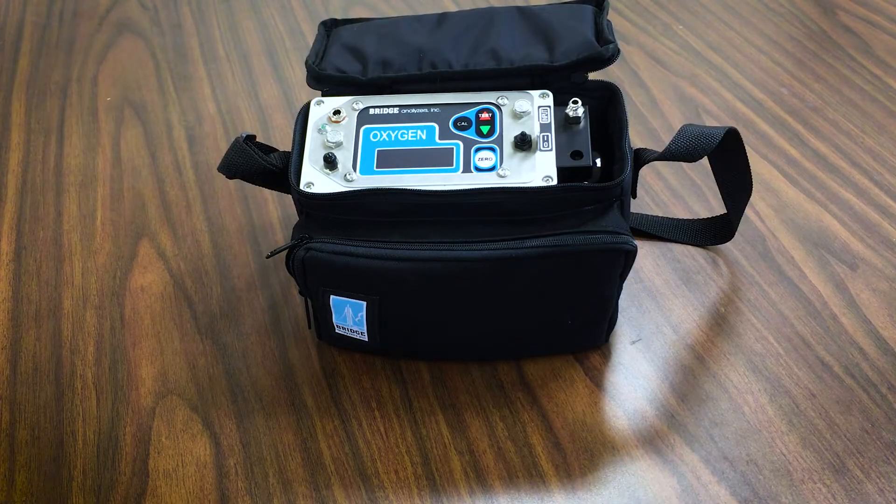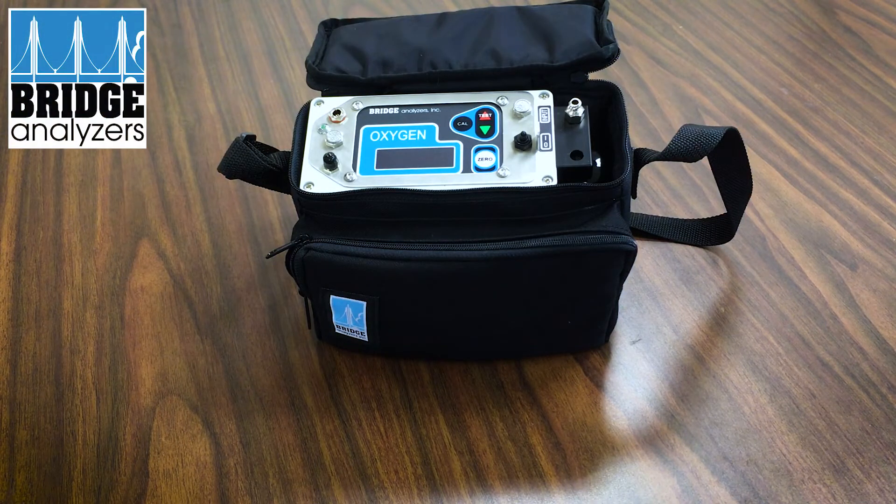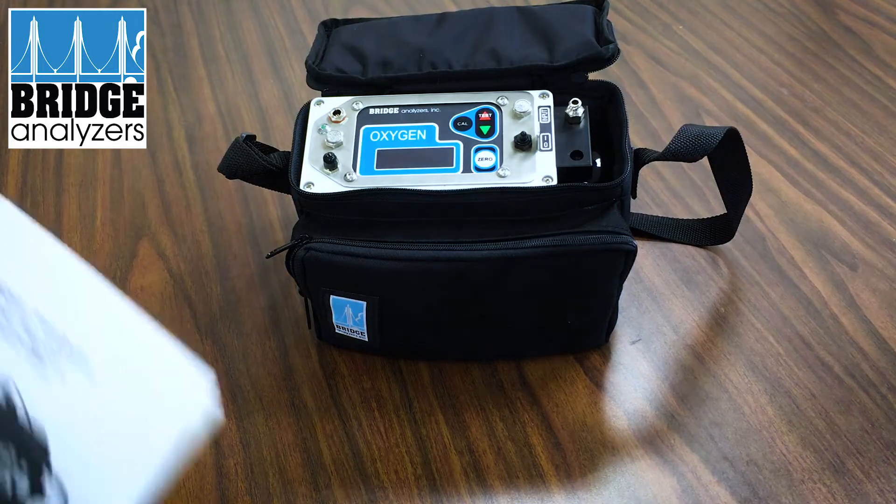In this video we're going to show the various components that you receive with the bridge analyzer and then walk through startup and general operation. When you receive the analyzer you receive several things in the package.